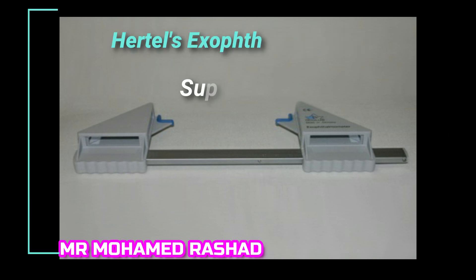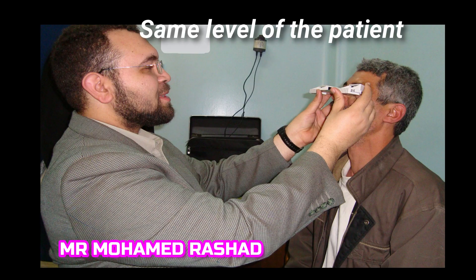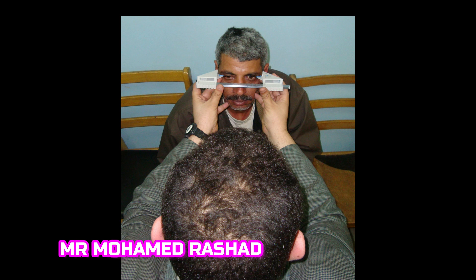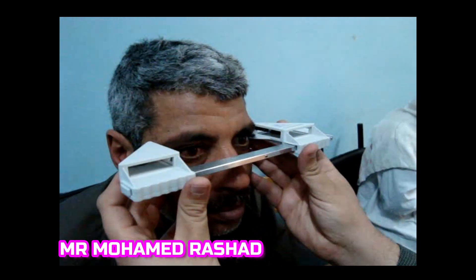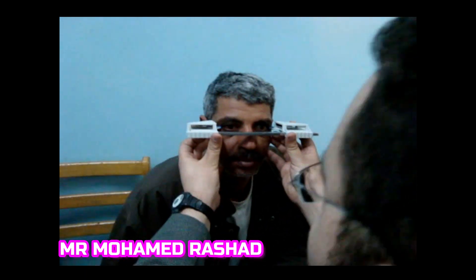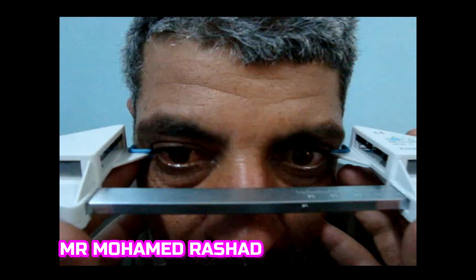With Hertel's exophthalmometer, you first read the number on the base and make it wide. The support part, which is the blue corner, must be placed on the lateral canthus. You have to be at the same level as the patient and put the support on the lateral canthus. Make it wide first, and look with one eye at a time to see the corneal apex. Try not to injure the eye of the patient — you can apply topical anesthetic. The patient must look straight ahead, and you support the instrument on the lateral orbital rim with your middle finger.